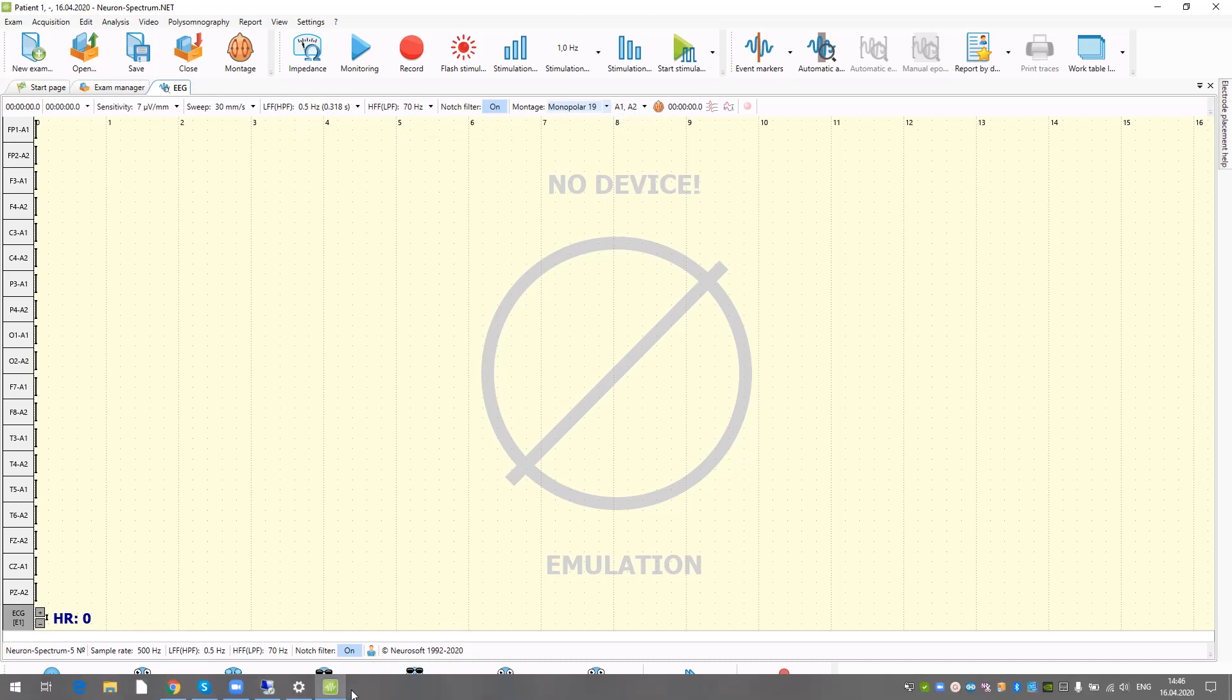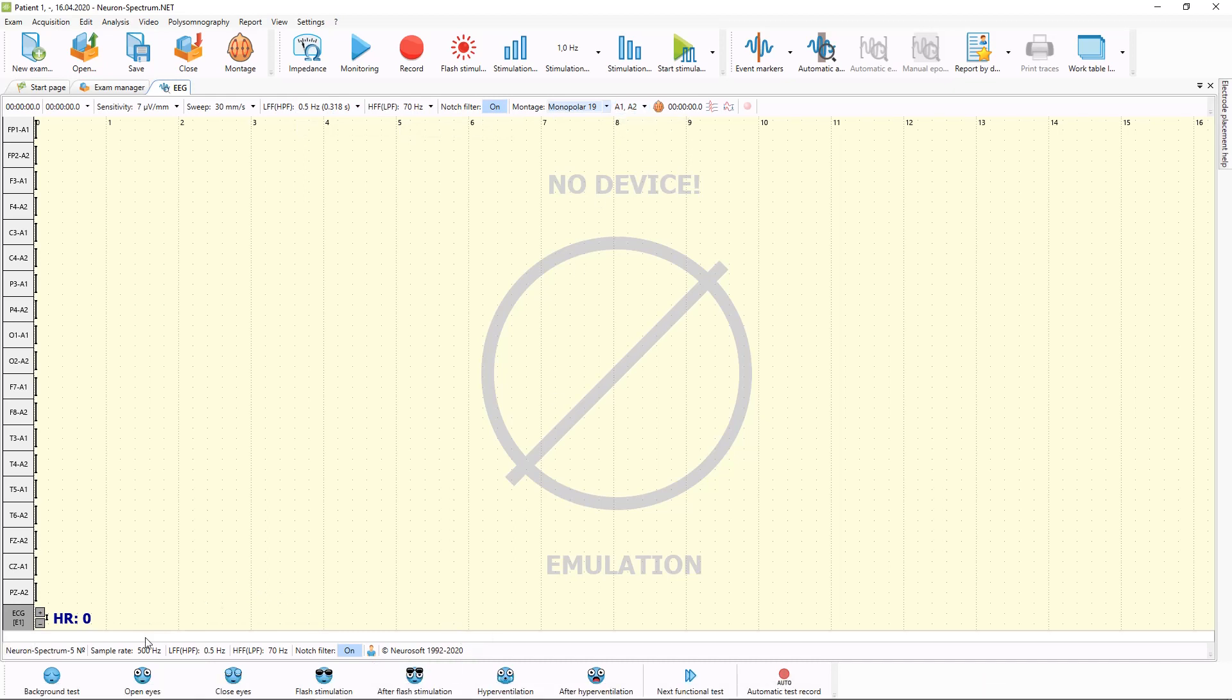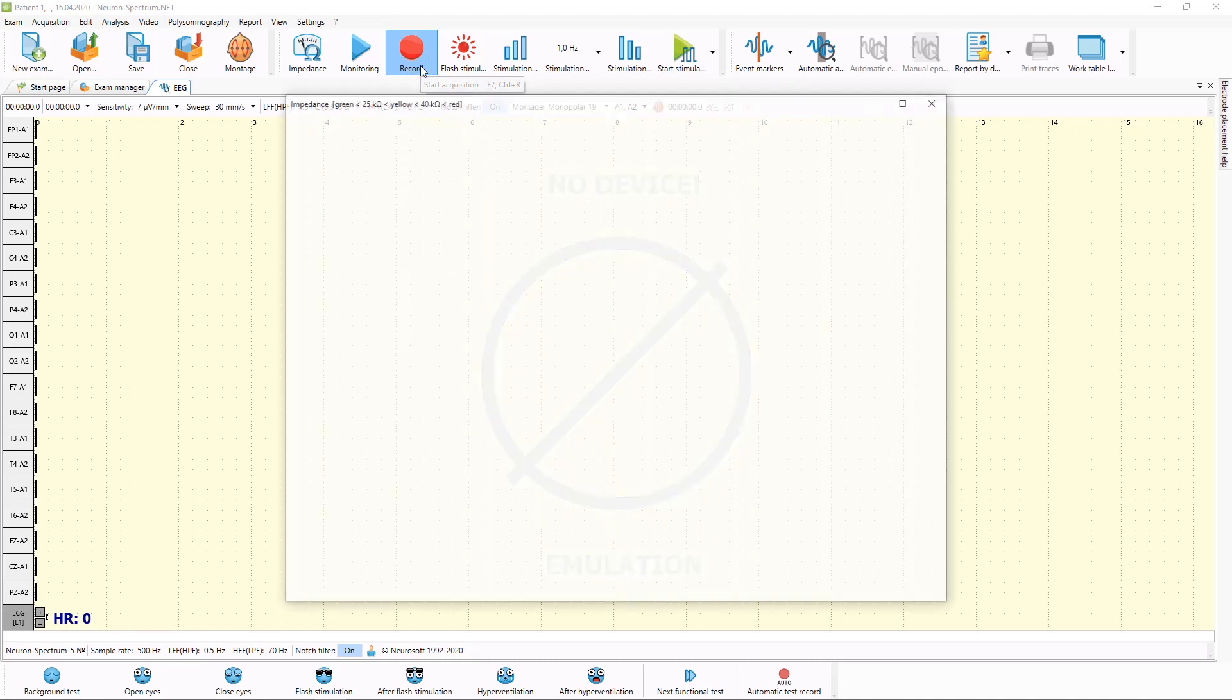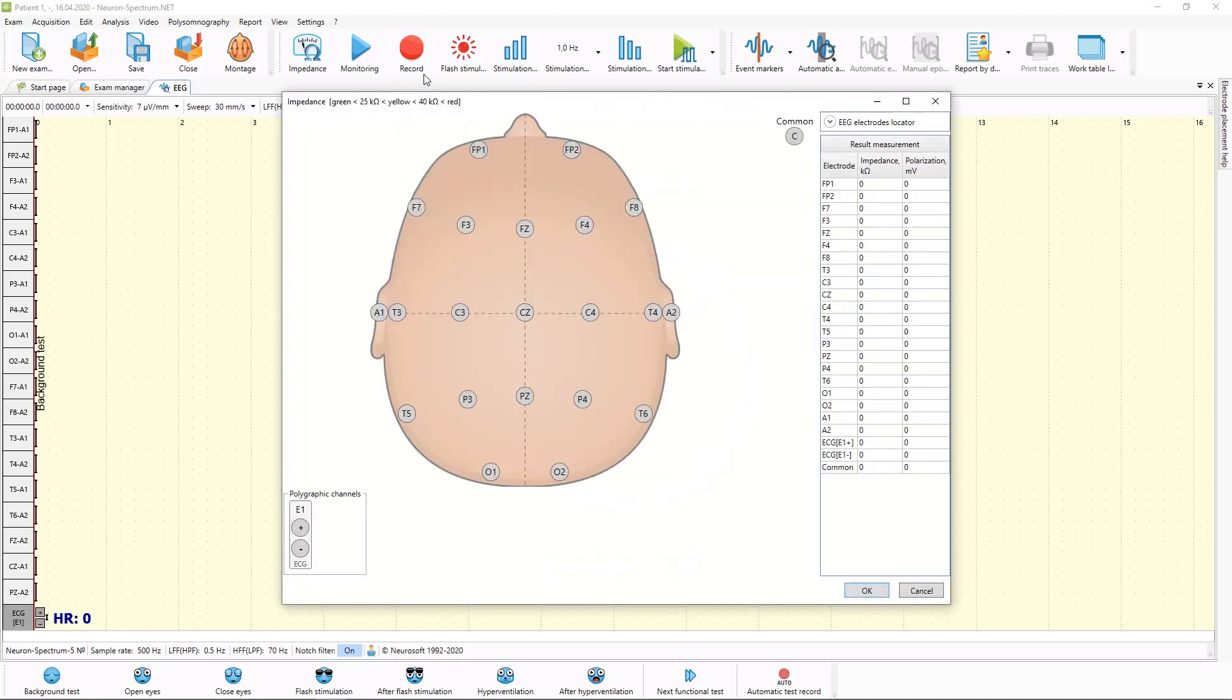On the bottom part, you can see current functional tests which were selected for routine EEG examinations. You can make recording in automatically mode, but we will use manual recording. When you press record button, software will start impedance measuring automatically.